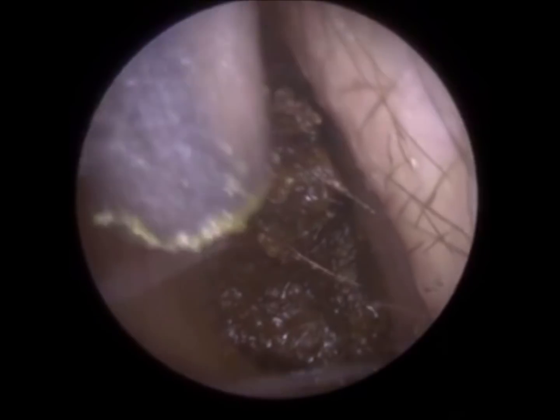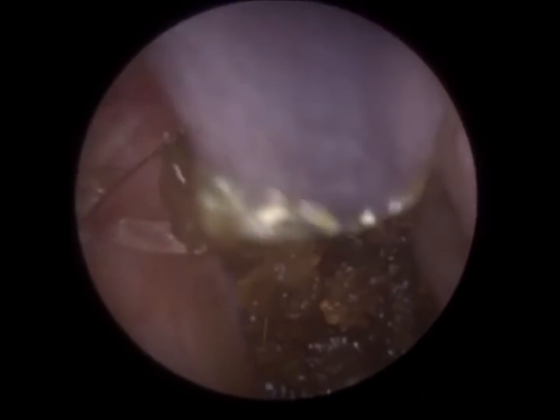So this first piece of wax detached quite easily, but it is quite sticky. So on a few occasions you can see that it's blocked the zone, the suction probe. So I'm just wriggling it and it's unblocked. So again, I'm just going to the roof of the ear canal.